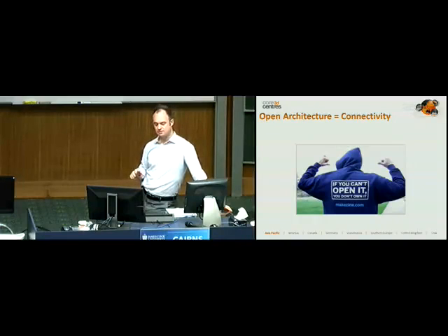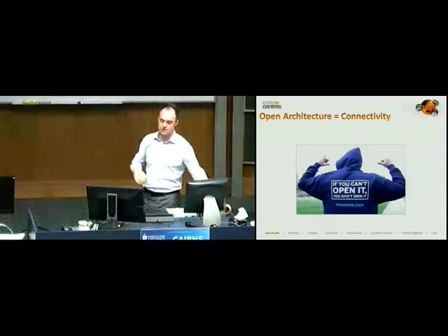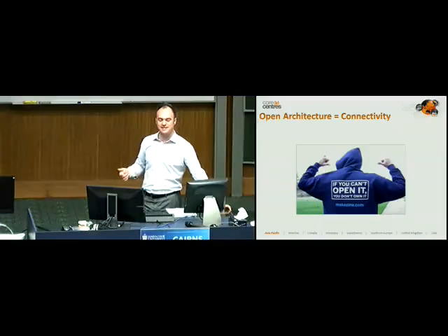The STL file is the file that I like to talk about because that's what you can use for both CAD and CAM, so computer-aided design and computer-aided manufacture. STL was brought about by a company called 3D Systems, and they used it predominantly in stereolithography, which is the printing of objects three-dimensionally. But the STL file has become almost the standard in my business, which is digital impressions and digital design of crowns and bridges. So I'm going to be talking a lot about STL, but DICOM is very much a standard in medicine. STL is more about the three-dimensional object represented on the screen.